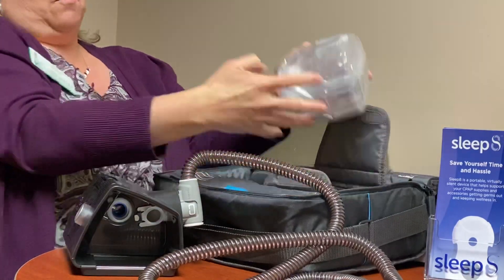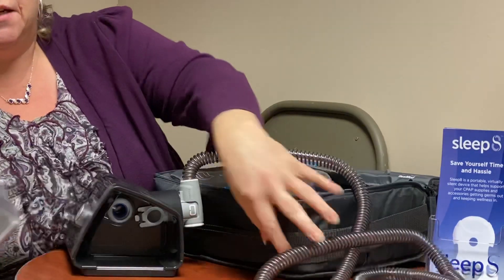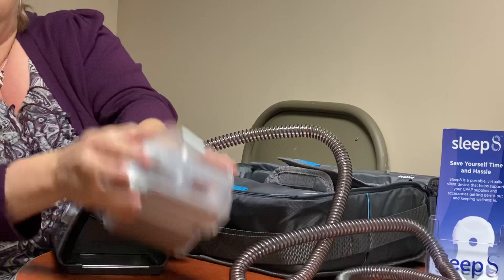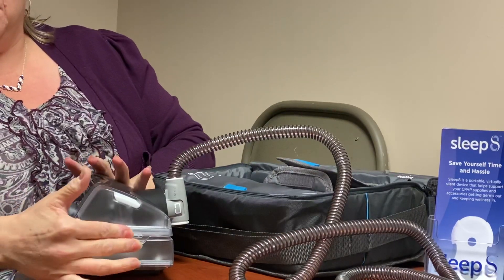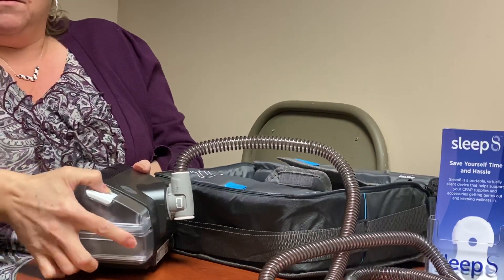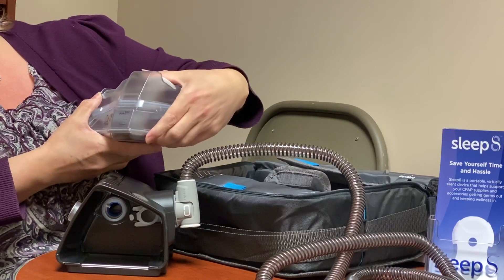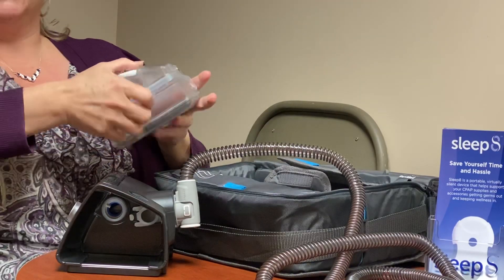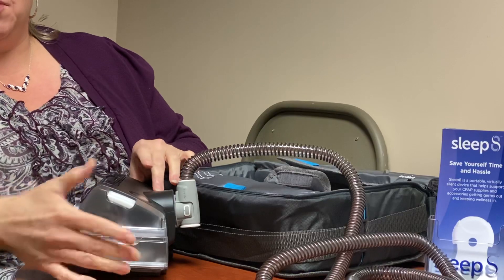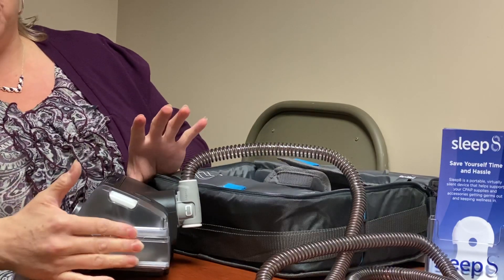Next thing we're gonna do is take out the water chamber. That is gonna go right into the side here — you can see that's your warming plate. It's gonna have a spot for your fingers and your thumb, kind of a grippy grip. Give it a squeeze to pull that out. This is how you're gonna get your water chamber in and out. There's a latch here to be able to open and fill, so put that in and fill it with your distilled water up to the water line right here, then go ahead and put that back in.